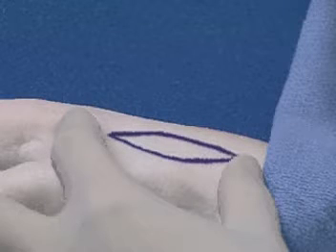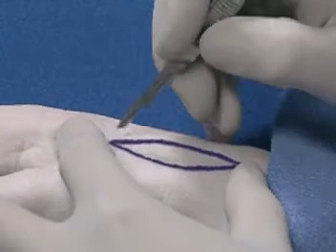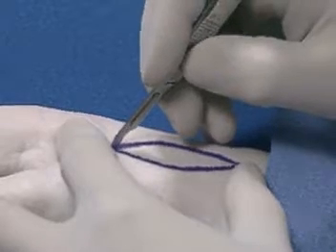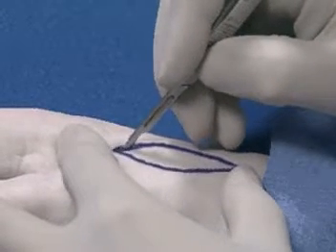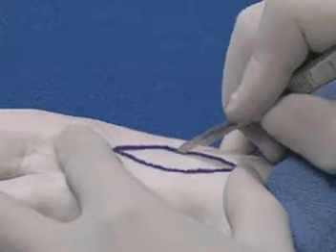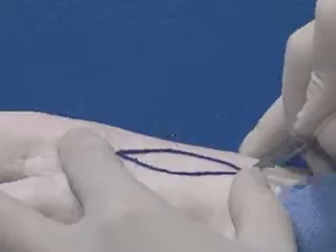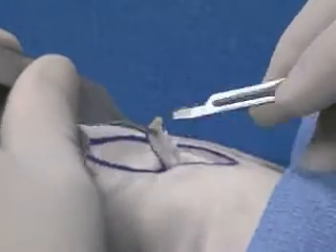The fusiform excision is marked with a length of one and a half to three times the width. The intervening skin and soft tissue is then excised. The incision made in the skin edge should be perpendicular to that skin edge. The fusiform to be excised can then be removed with sharp dissection using either knife or scissor.